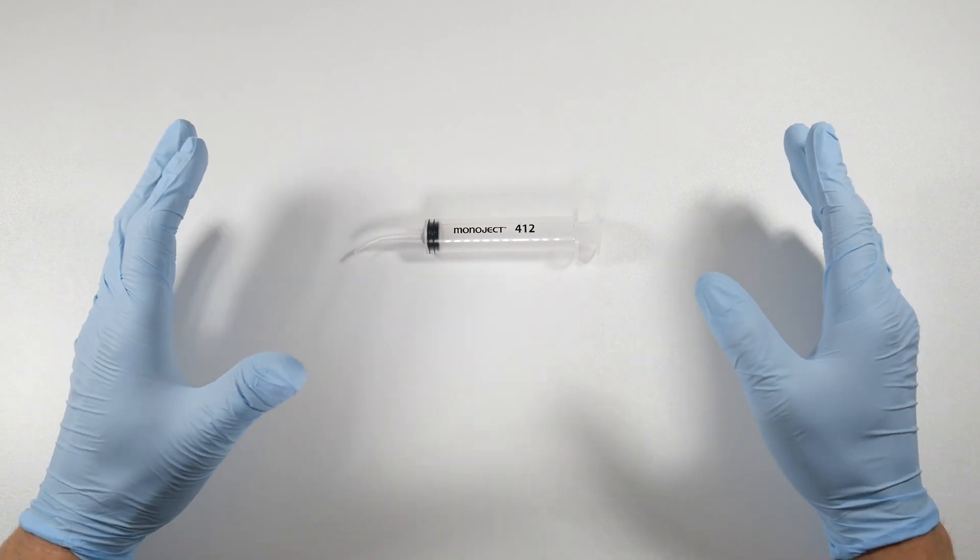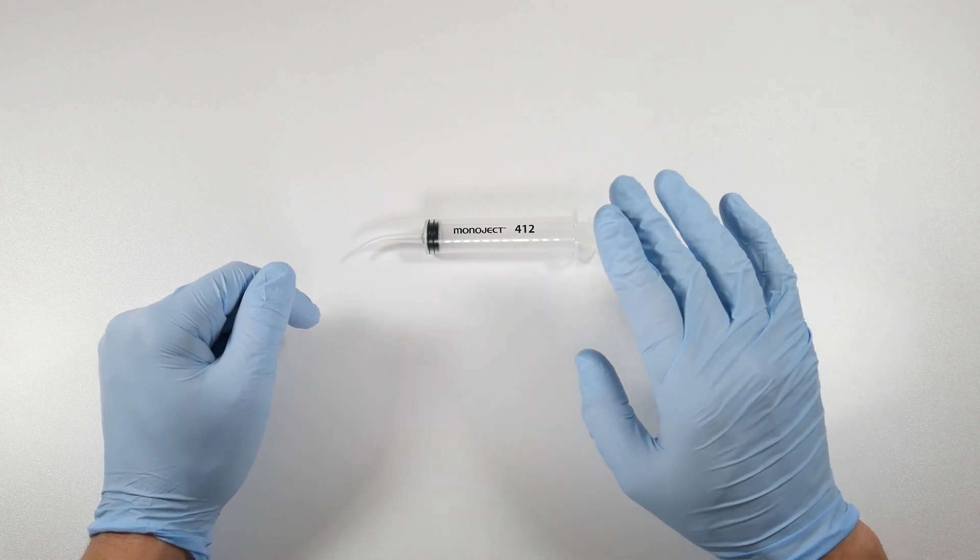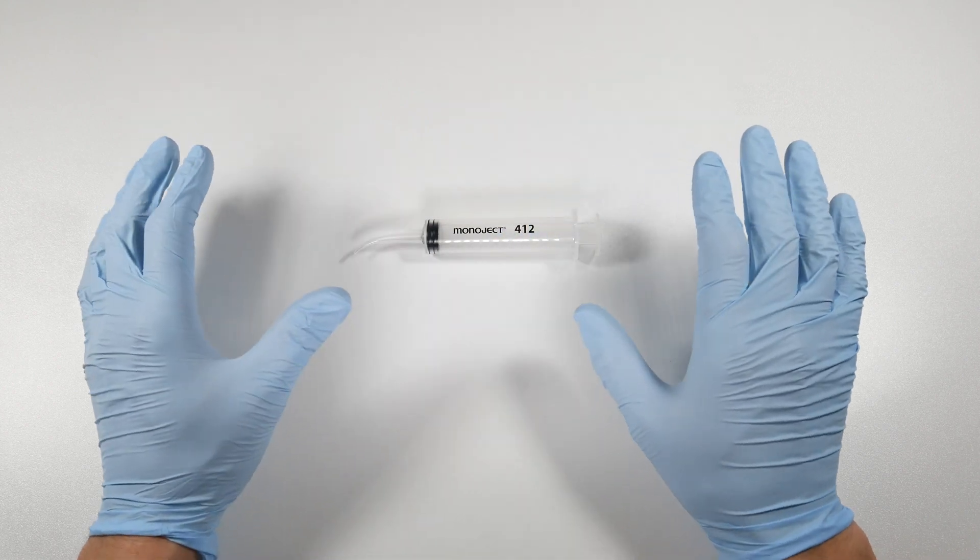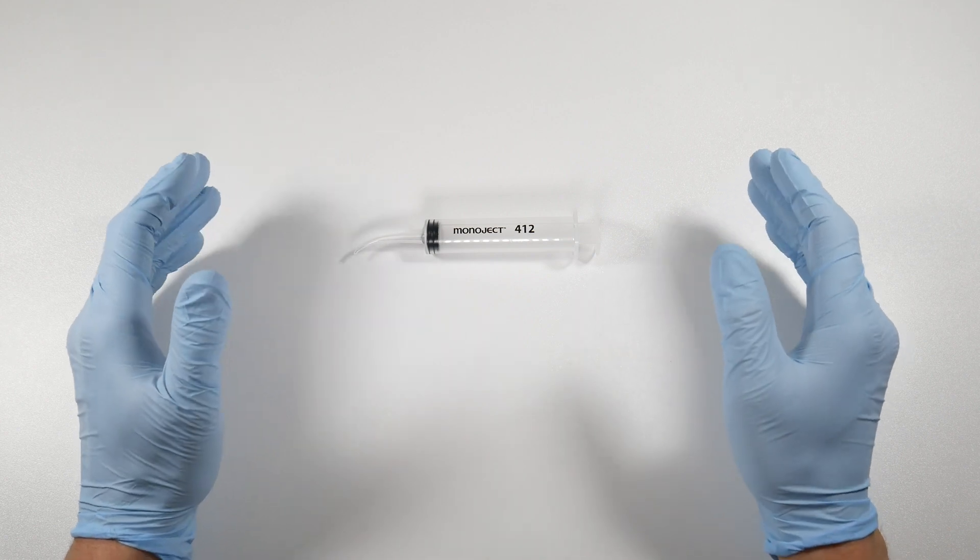How much fluid is actually sufficient when we're irrigating a site? That's a great question. For most cases when it's a simple extraction or surgical extraction that's not a third molar, I would consider using this which is 12 mils of fluid—that's often more than enough.